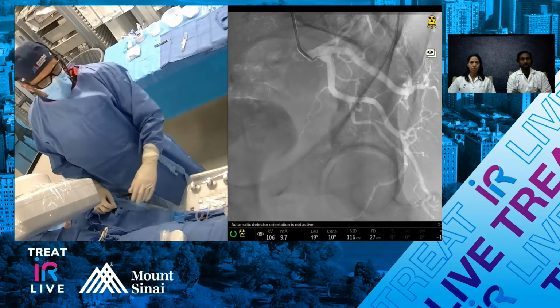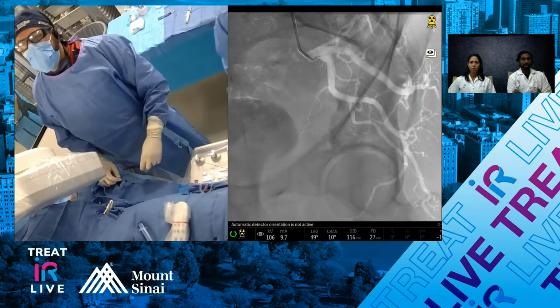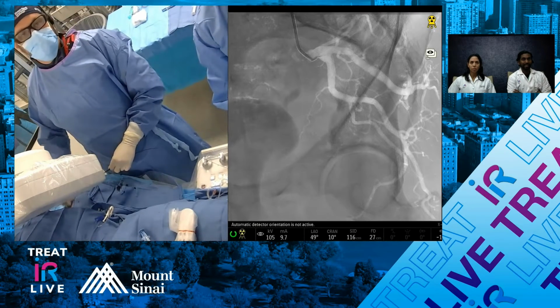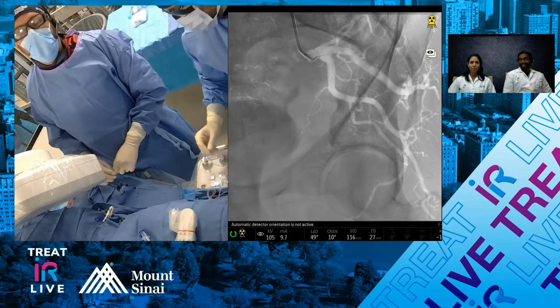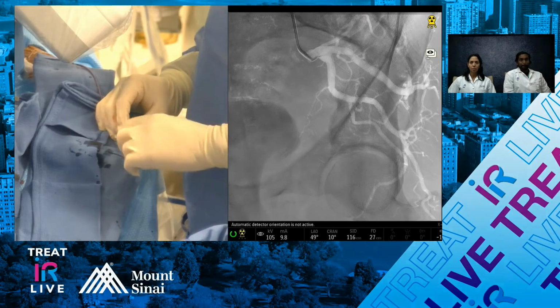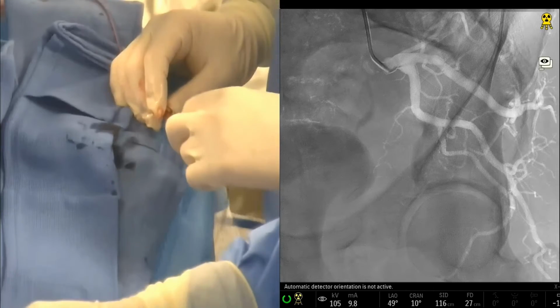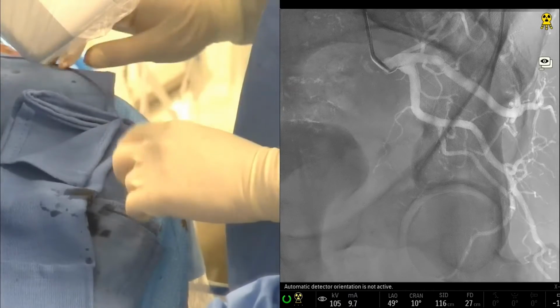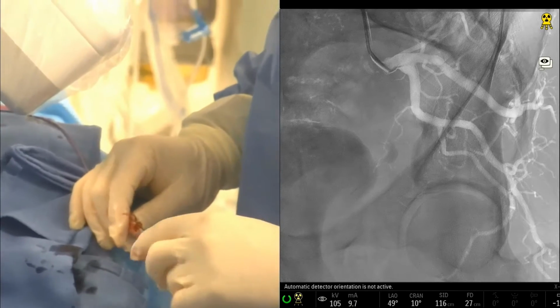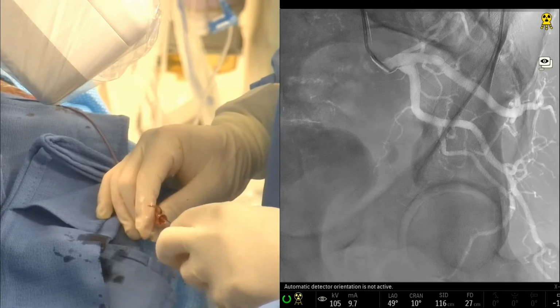In terms of patient selection, do you have a size cutoff minimum volume-wise for the prostate? Well, that's an interesting question. That's a completely separate question. Look, smaller prostates are much harder to embolize, as we all know. Plus, they're not going to get the same volume reduction and potentially the same response. And so, the smaller the prostate, the harder it is, and I think the less likely you're going to get a dramatic improvement. It doesn't mean that you can't get it. It just makes it a lot more challenging. So there is no real cutoff, Jay, but I think, once you get below 40, it becomes really, really hard.